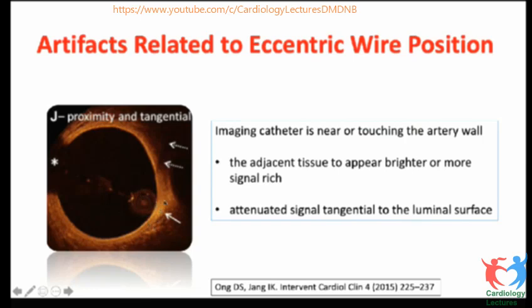You should not mistake this for a fibrous plaque or something. It is nothing but the proximity of the catheter to the vessel wall. So it is called proximity artifact. The second one is called tangential signal dropout.